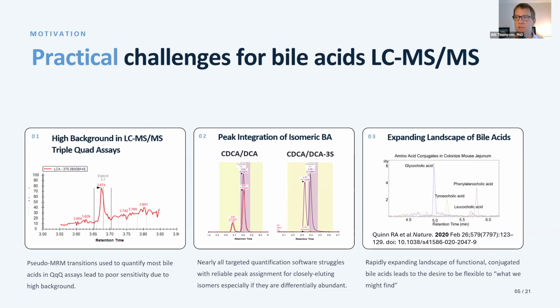And then finally, with this expanded landscape of bile acids, having a locked-down kit that doesn't look for the myriad of other things that have been publicized by Pieter Dorrestein and others, this landscape of functional conjugated bile acids is ever expanding. And so this is a real downside to using traditional methods for bile acids analysis.